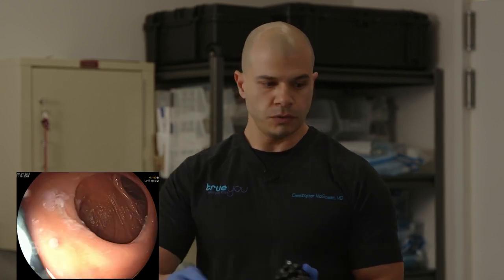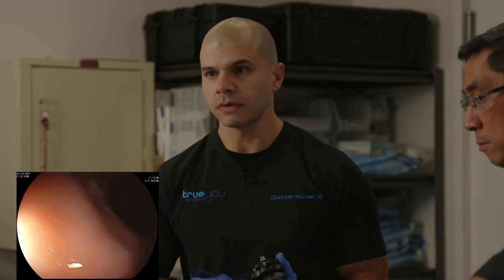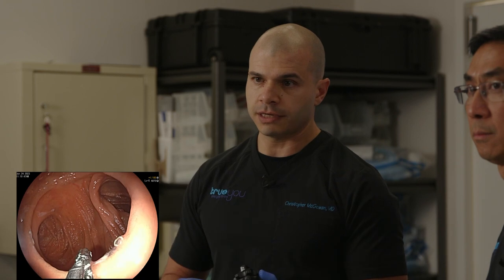I'm just going to remove those to begin with, just so they don't get in the way of what we're about to do. And again, keep supplying your questions, and we'll start answering those soon. But first, what I'm going to do is take these staples out. Now, when this surgery was originally done, this is a surgical stapled anastomosis. They're actually staples all the way around here. You can't see them all, but these two have poked out over time. So I'm just going to remove them.